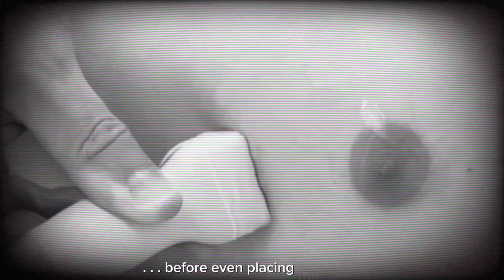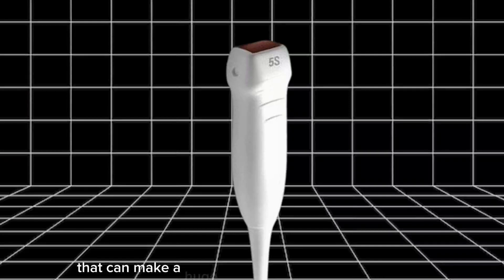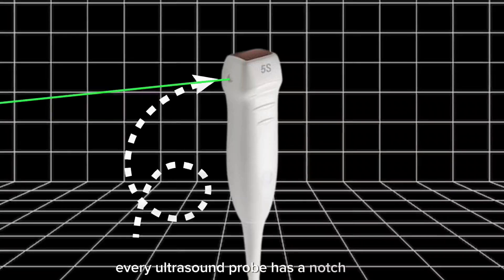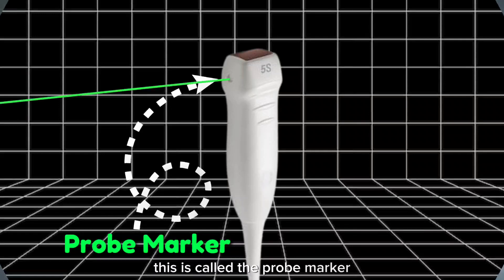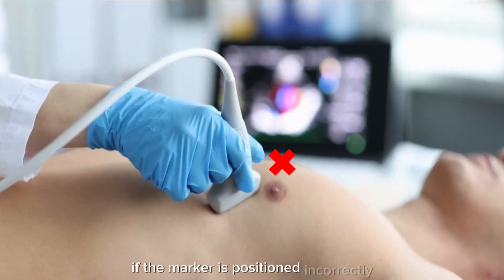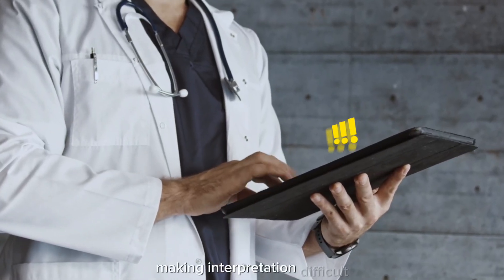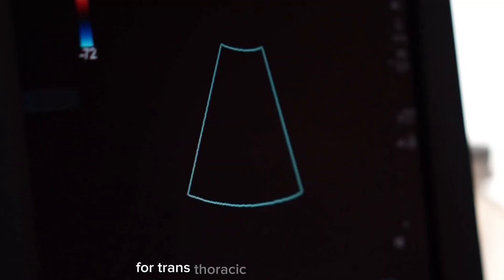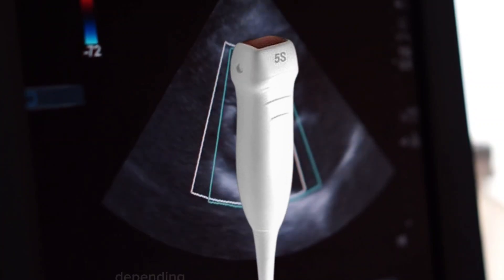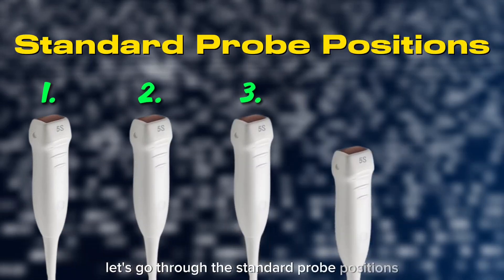Before even placing the probe, let's talk about probe orientation — a small detail that can make a huge difference in your image quality. Every ultrasound probe has a notch or dot called the probe marker. It determines how the image appears on the screen. If the marker is positioned incorrectly, your images will be flipped or distorted, making interpretation difficult. For transthoracic echocardiography, the marker should always be directed in a specific way, depending on the view you want to obtain. Let's go through the standard probe positions step by step.